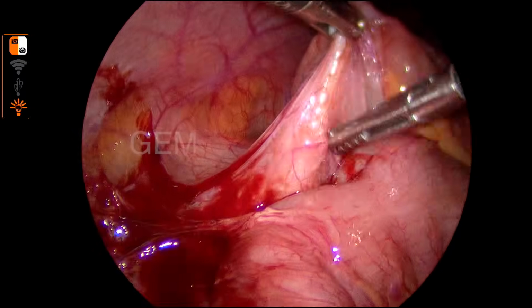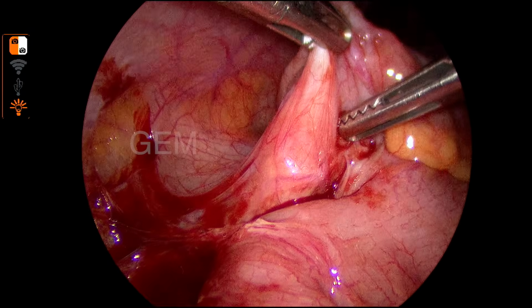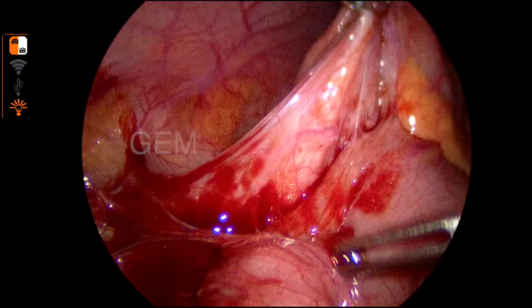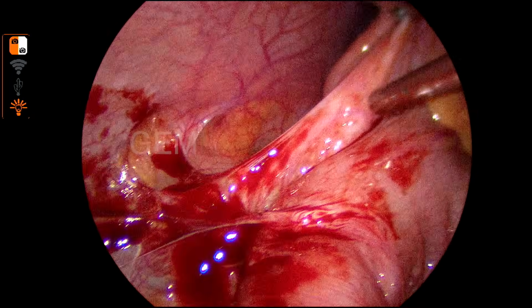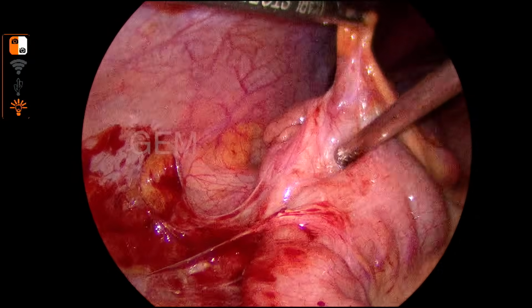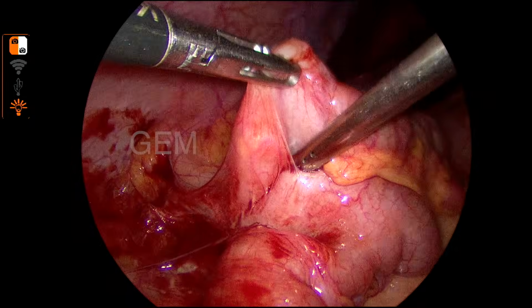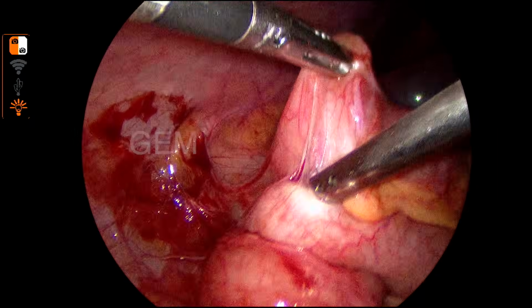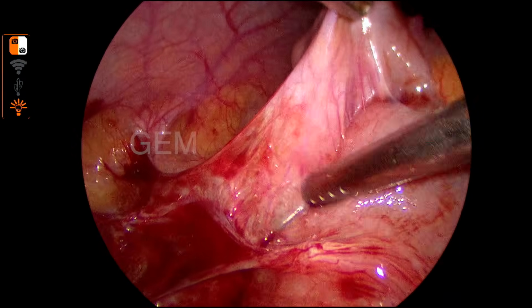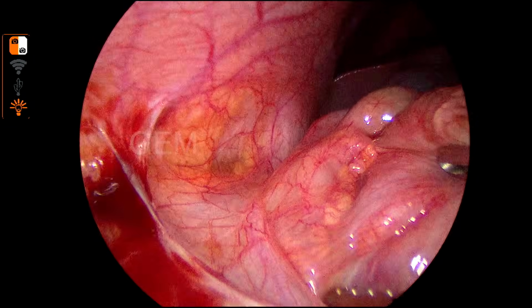So that is the retrocecal area. That also, the appendix is not seen. Pelvic position is also not there. So it must be retroileal. So he is mobilizing the ileum, and there also he couldn't feel any thickness. Retroileal means that area will be thick. So he is trying to separate the ileum, but this is not an ideal way. Actually, you have to hold the ileum and then do short dissection, not hold the cecum.